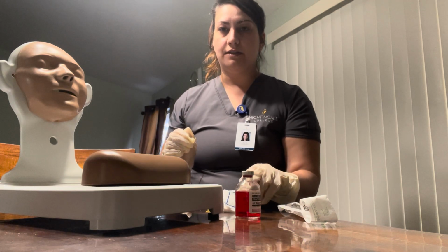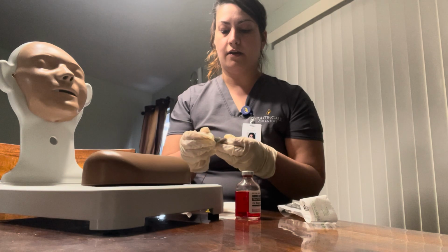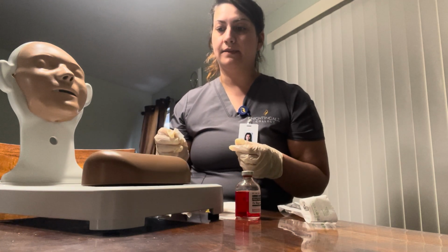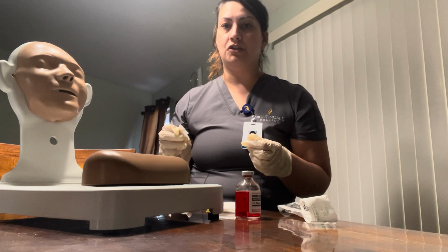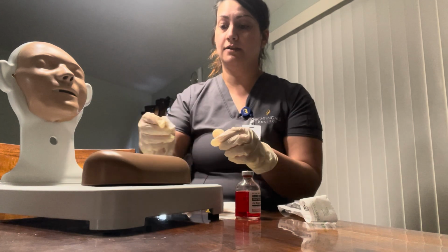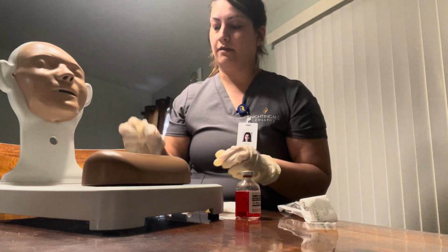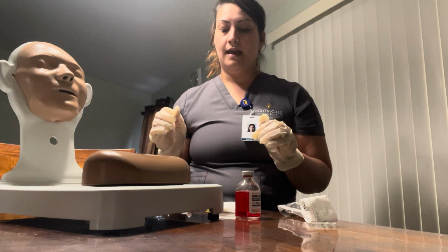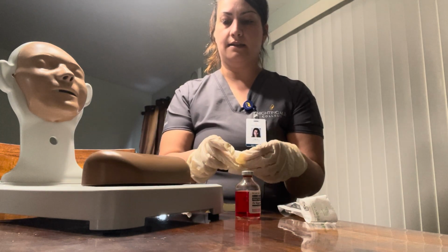Next, I'm going to take my alcohol wipe, and we are going to clean the area, starting about 5 centimeters, 2 inches out. There we go. We discard this and we let it dry. We do not touch it. Next, we are going to get ready to inject.